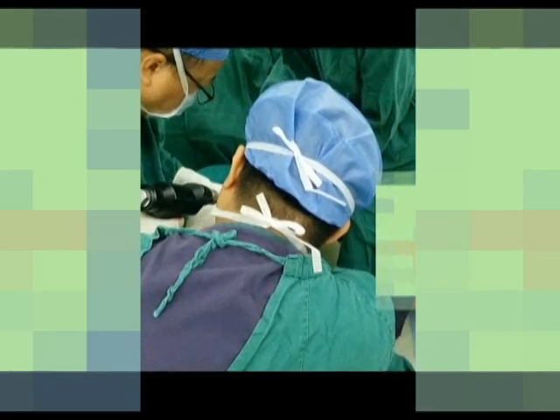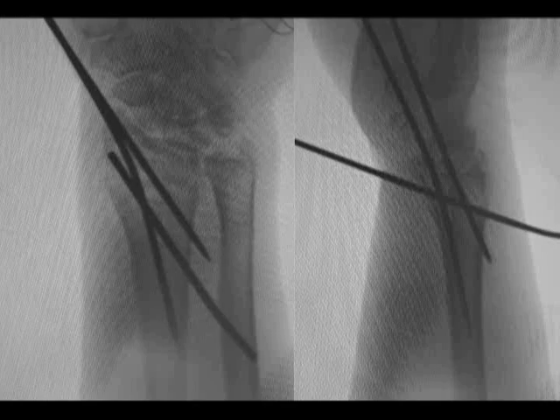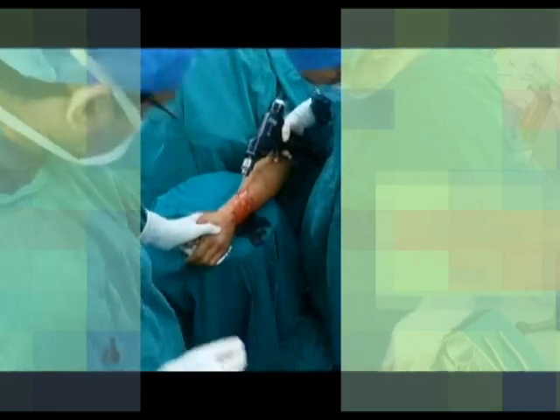If satisfactory reduction is achieved, we insert two 2.5 mm K-wires from the radial styloid process obliquely into the proximal fragment. Satisfactory reduction and wire position are confirmed under C-arm. Then we insert a third 2.5 mm K-wire from the radial side of the radius to the sigmoid notch, just beneath the articular surface of the distal radius.